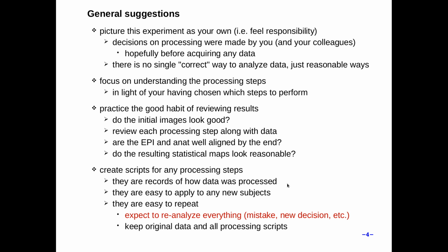You can use graphical interfaces to manipulate the data, play with commands, get a feel for what should be done, but in the end, everything you do can be moved to a script. And then there's no question about how to analyze the data. The scripts are also very easy to apply to new subjects. It's much harder to remember all the buttons to click. You just script things and then you're done.